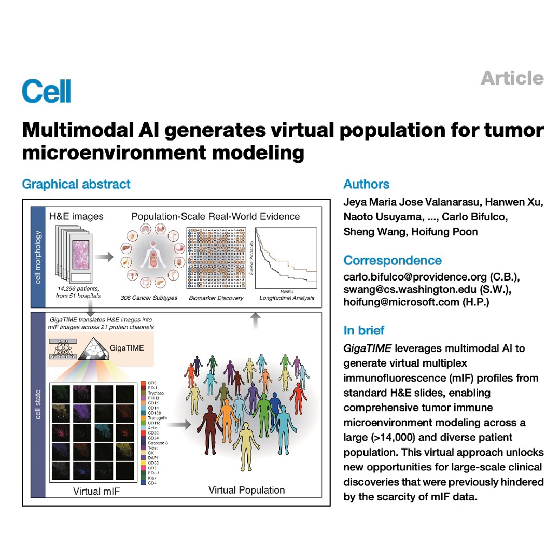And speaking of therapies, what about the big one, PD-L1? So, first, the virtual PD-L1 activation correlated positively with the clinically reported PD-L1 tests, which is a crucial sanity check. Right, it has to match reality. But then, when we compared it to cell dynamics, we found something new. High PD-L1 was negatively associated with proliferation markers like Ki-67 and also apoptosis, or cell death markers. So what does that suggest? It suggests that high PD-L1 might be tied to a less active, more dormant tumor state. The immune blockade is effectively keeping things in a kind of stalemate.